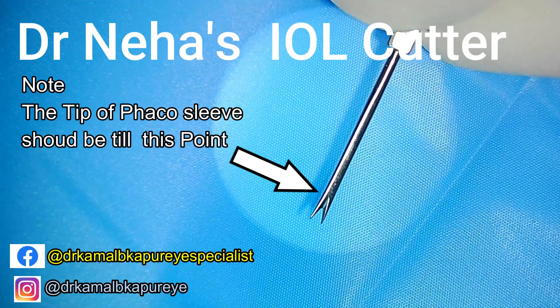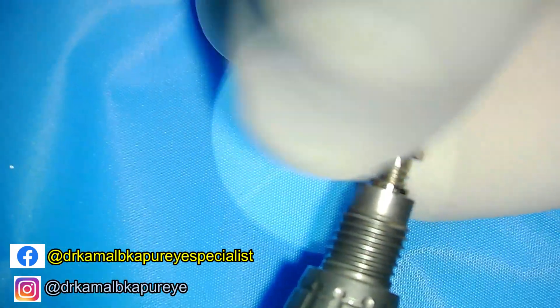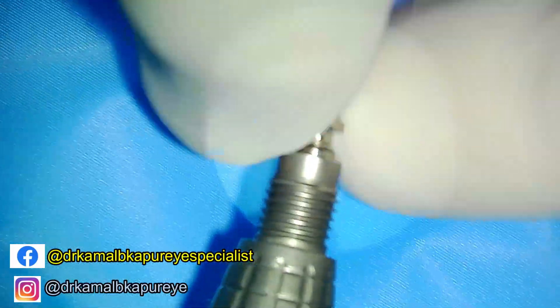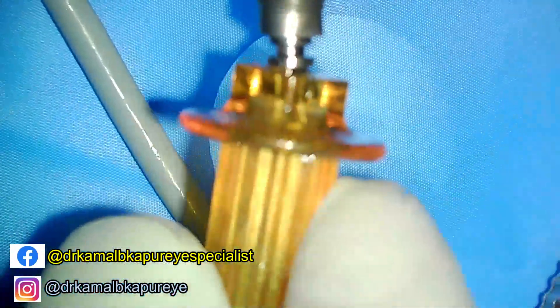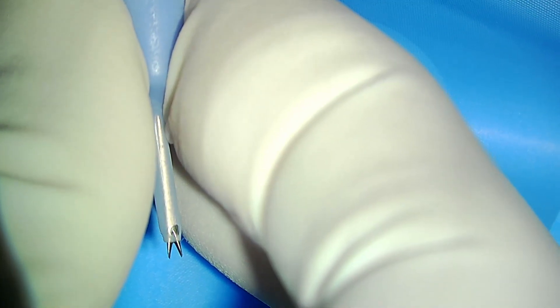Now let us see how we load this cutter onto the phaco tip. The sleeve of the phaco tip usually comes to the cutting edge of the cutter. Once you tighten the cutter onto your phaco tip, slide the phaco tip slowly and make sure that the holes are perpendicular to the cutting flanges angle.